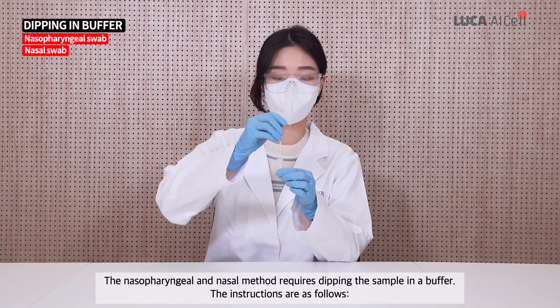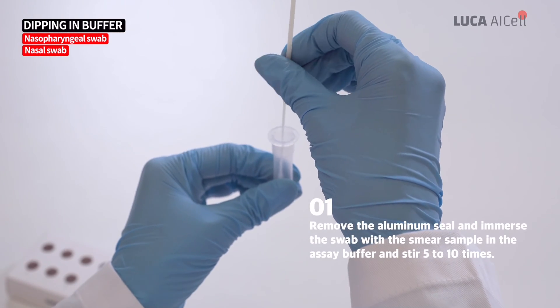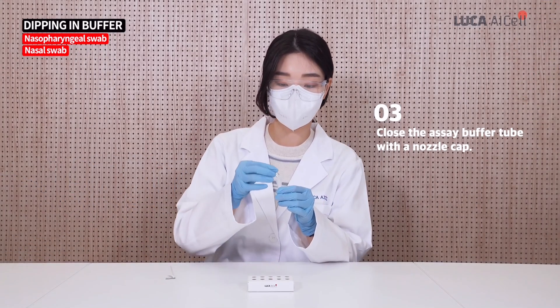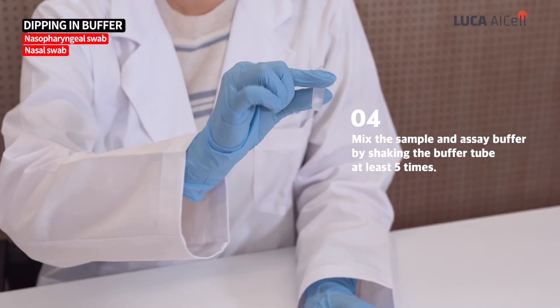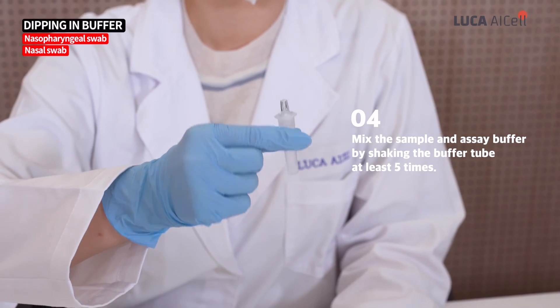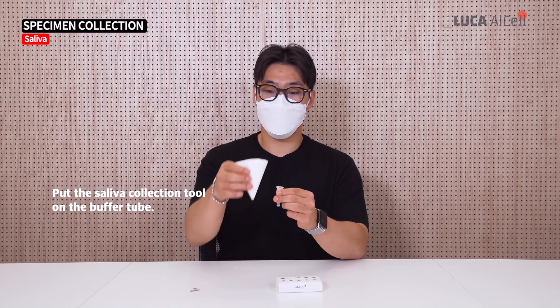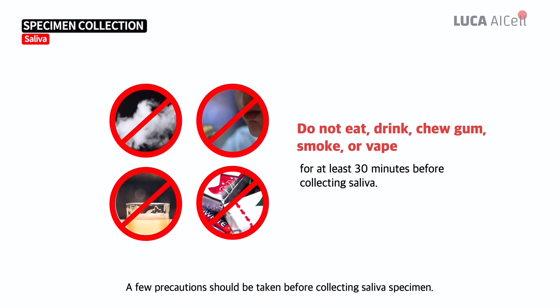The nasopharyngeal and nasal methods require dipping the sample in a buffer. The instructions are as follows. The third method is saliva collection. A few precautions should be taken before collecting a saliva specimen.